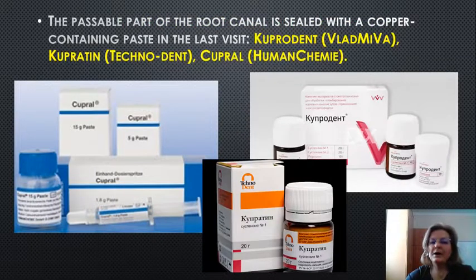After that, the passable part of the root canal is sealed with a copper-containing paste at the last visit.